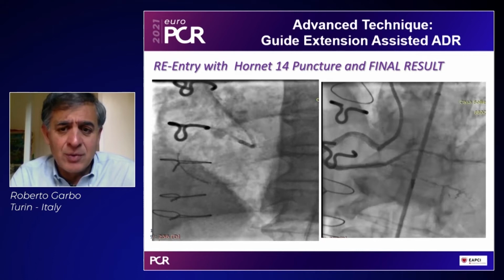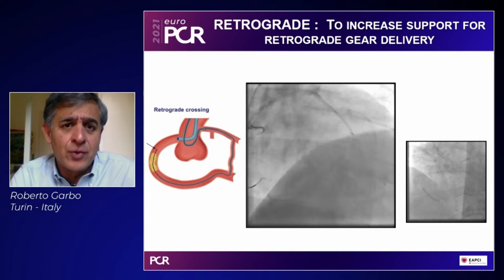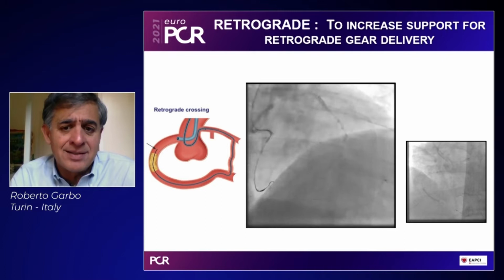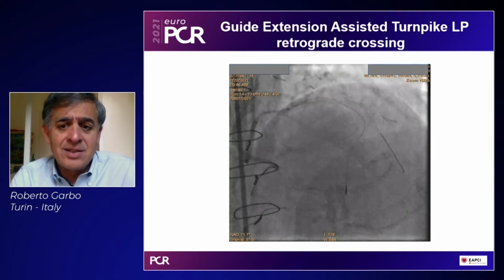In the retrograde approach, we have many situations in which the guide extension is useful. You can see here it increases the support for retrograde wire delivery. This is a situation in which I had to face a complex epicardial connection from the LAD, and I had to put my guide extension very distal to complete the procedure.